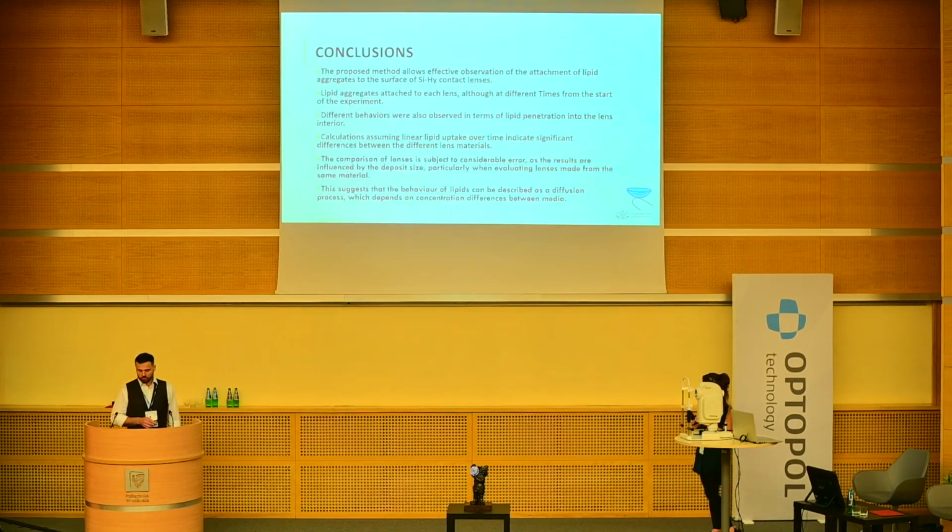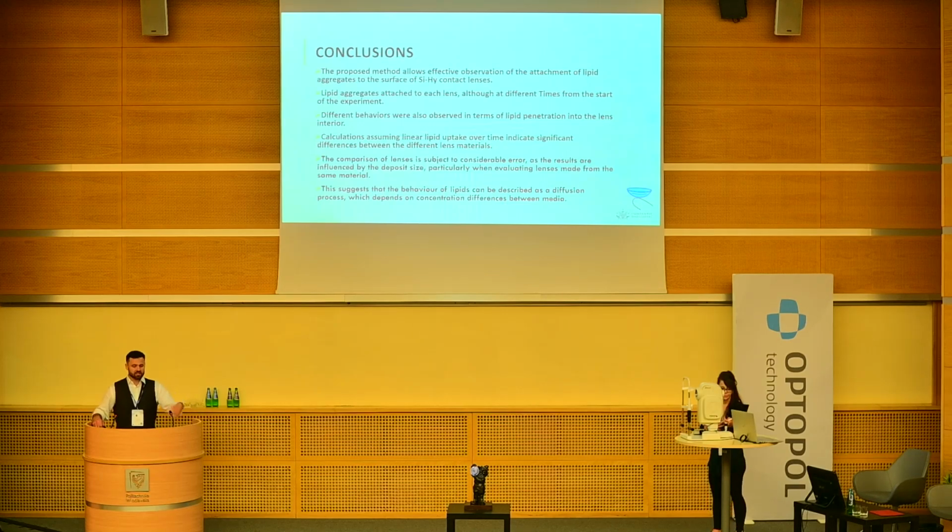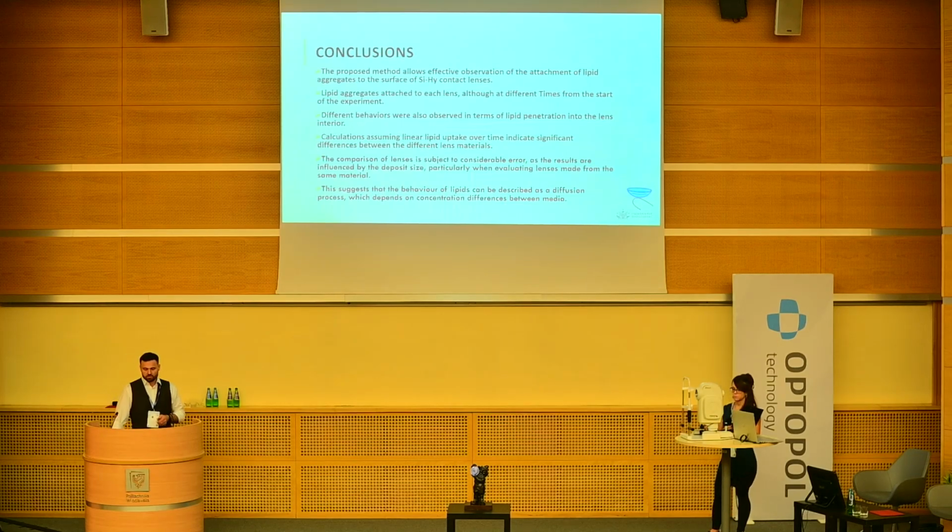So just to conclude, this method allows us to effectively observe the attachment of the lipid aggregates on the surface of silicone hydrogel contact lenses, different types of contact lenses, but all of them were silicone hydrogel, built from different materials.